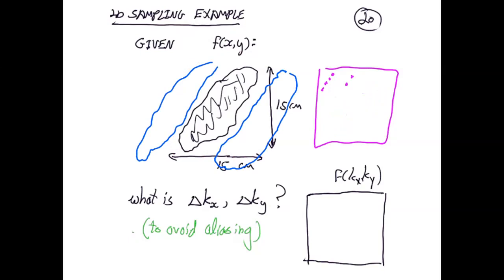It's going to be annoying, but they're not going to overlap. It's kind of like the nose wrapping up with the back of the neck, but not touching it. That could happen, right? Like if I have a head and a neck, and then a nose over here, the nose could appear over here, but it's not overlapping. So it's similar. The answer, which is also a tricky question, is really that you don't need to change the sampling in order to avoid aliasing, right? Because the object is really 5 centimeters wide anyway. Weird, huh?